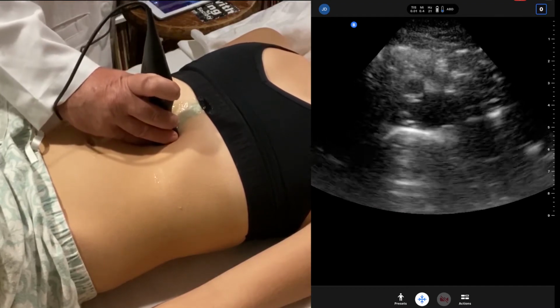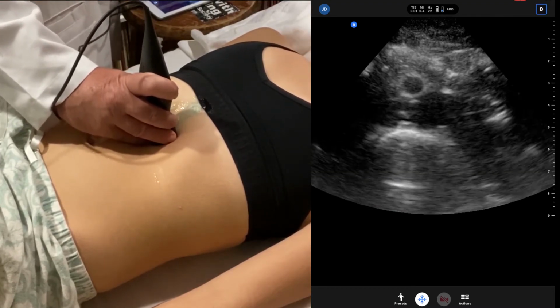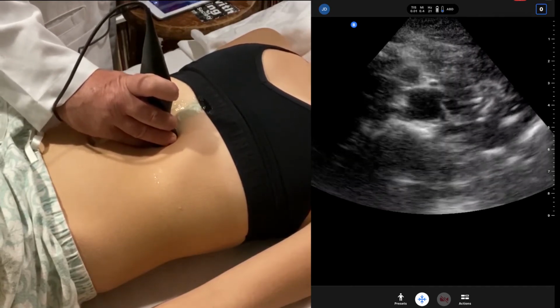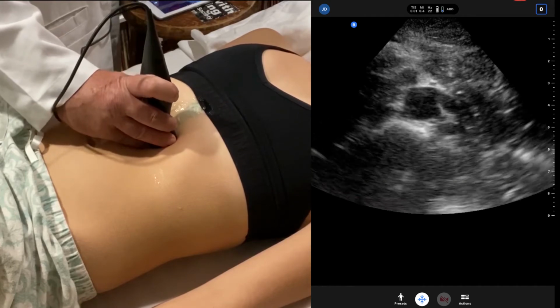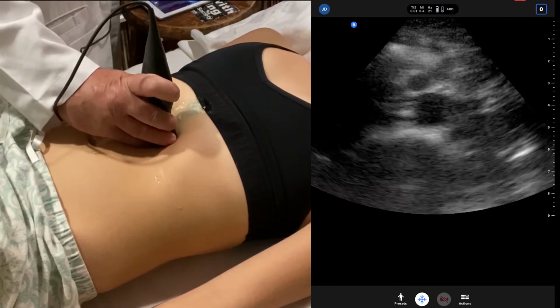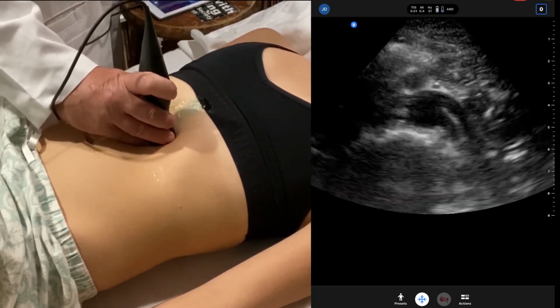Now, as we move down the aorta, to our third stop here, you will hit the mid-aorta. Now, this area is the hardest to view for the abdominal aorta because we have the transverse colon along the top. So we must apply pressure and move the bowel gas shadowing.